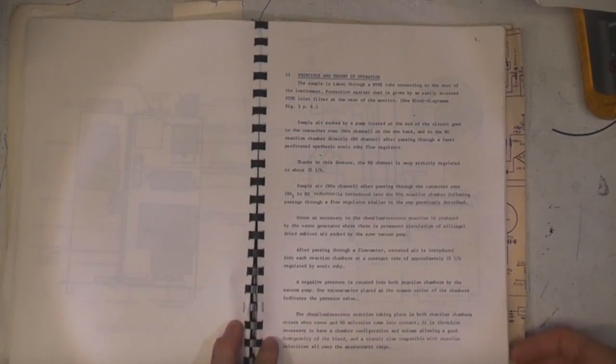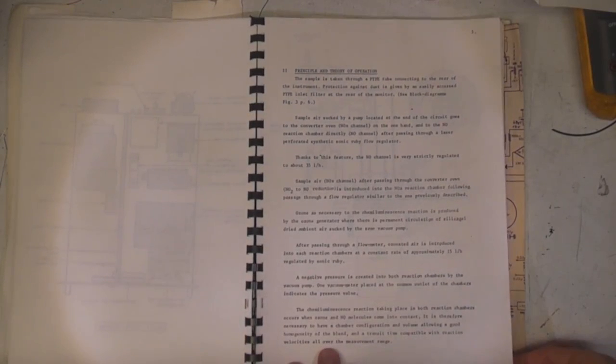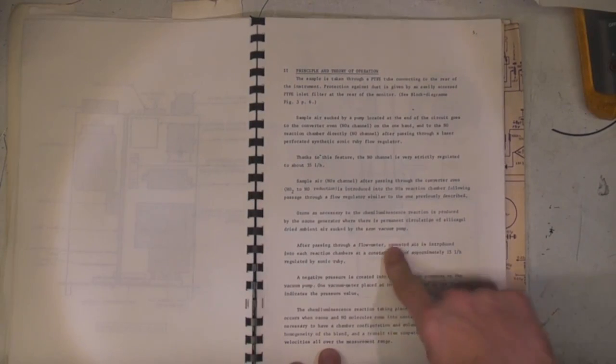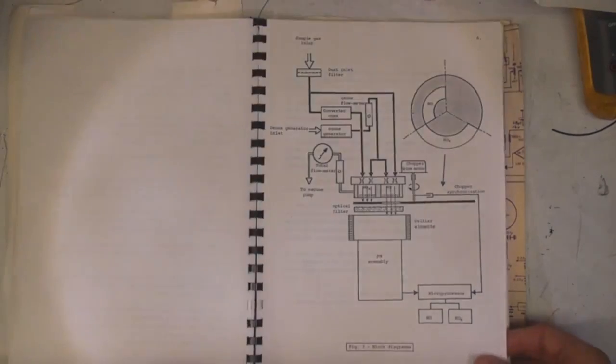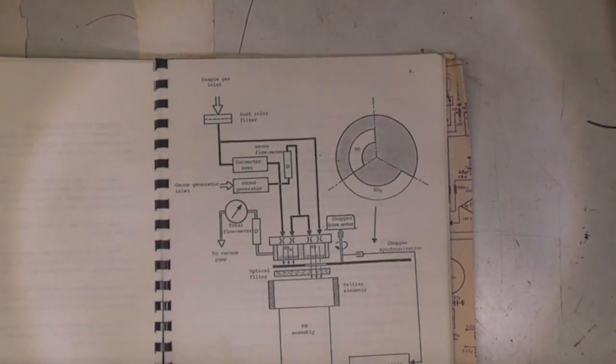All these analysers use some phenomenon which is basically optically detected. It's either fluorescence or luminescence, so they produce a chemical reaction that produces an amount of light, and the amount of light gives information about how much of the gas of interest is present. This one actually uses ozone - there's an ozone generator in there that produces a reaction in a reaction chamber, and the light produced from that is then measured using a photomultiplier. We've got a quite detailed drawing here.